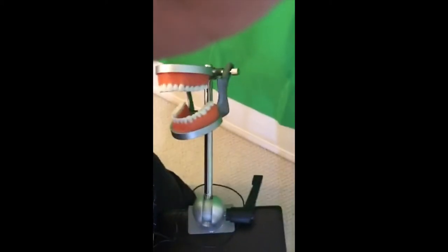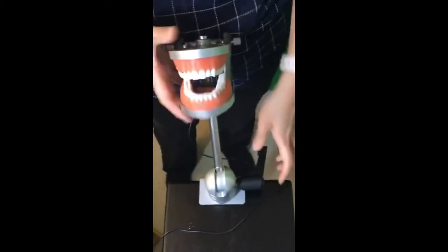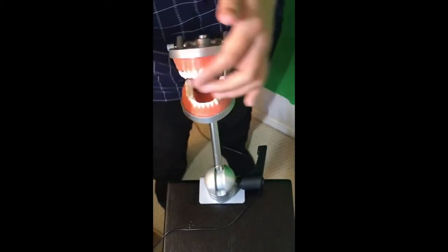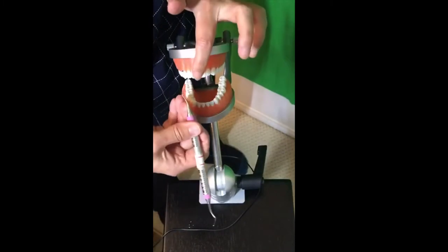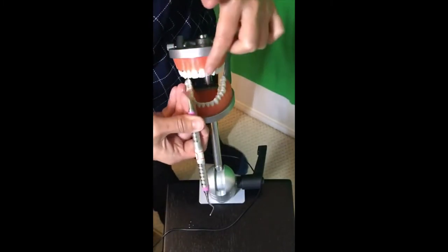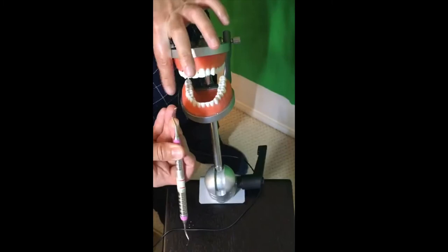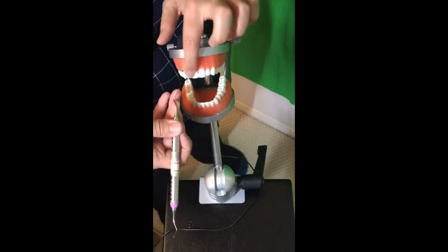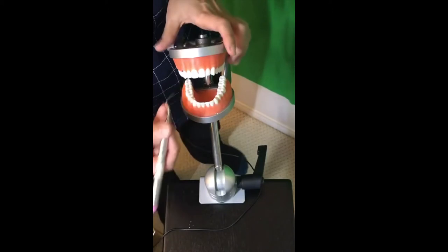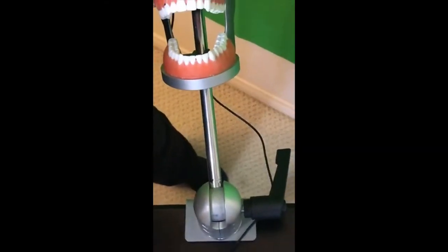I only have one side of the Barnhart, but that's okay. We're going to do anterior teeth. Remember, the Barnhart is curved — it hugs the two sides. Surfaces away use one end, surfaces toward you use the opposite end. I love using a Barnhart for maxillary anteriors — I think it fits really well. I'll be around the 11 o'clock position with an intraoral fulcrum. I'm going to do surfaces away first since that's the only end I have.